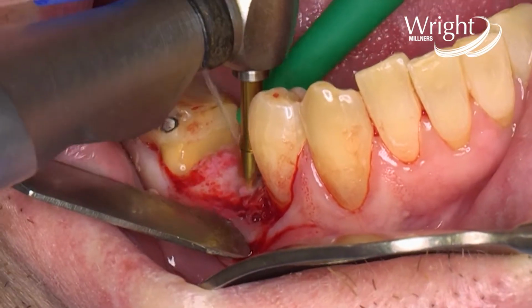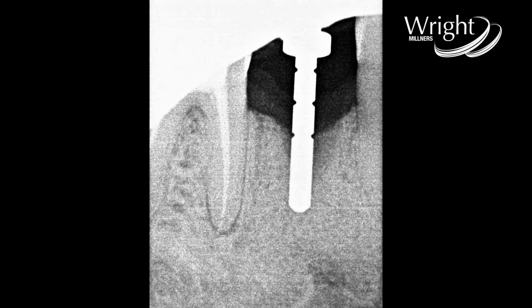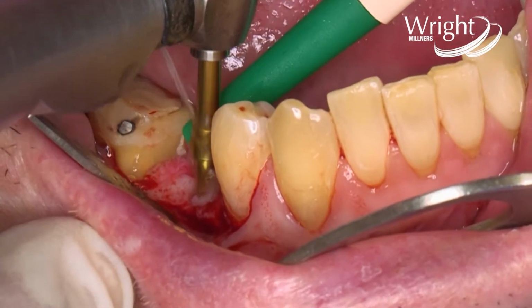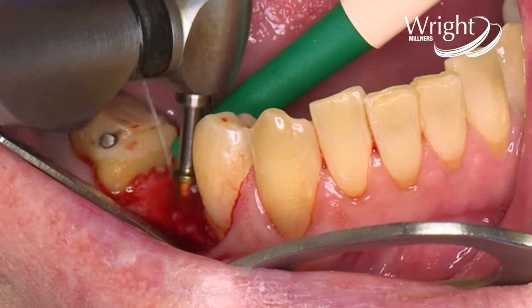Okay, so my plan is to place an 8.5 length, but with these type of implants, you want to place them subcrestally. So we will actually drill beyond the length we want to, even though these drills do take that into account. So I'm going to use the 10mm drill, and we use our next in the sequence of drills, which is actually the 2.8 drill.